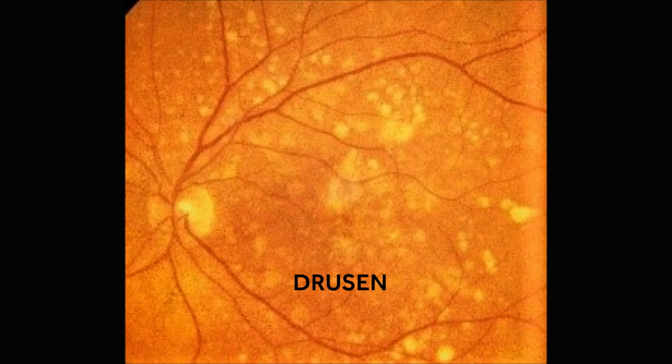An undilated pupil can allow a reasonable view of the disc, but only limited observation of the posterior pole of the eye. This can only be seen in detail after the pupil is dilated, and they can be examined by asking the patient to look directly at the light. Examples of abnormalities at the posterior pole are shown in the following pictures.